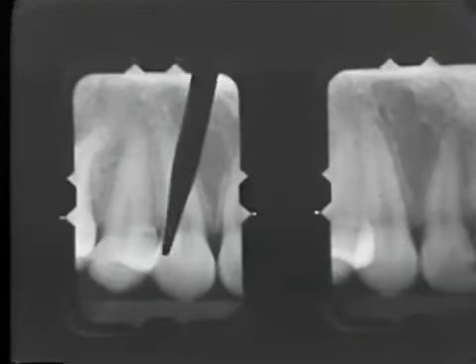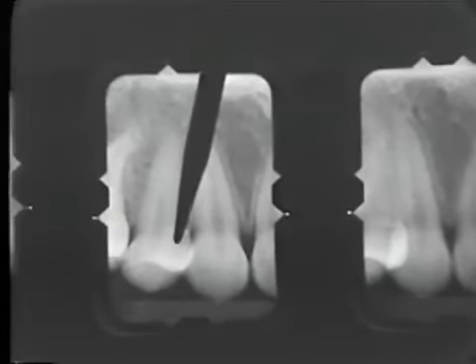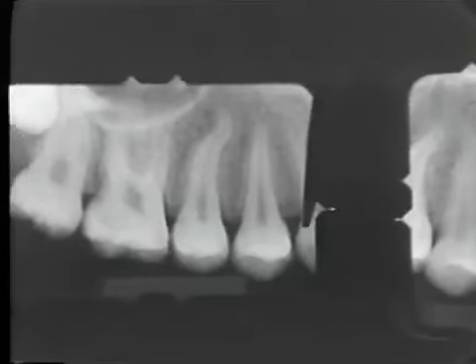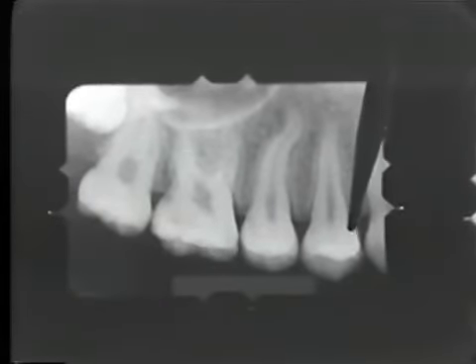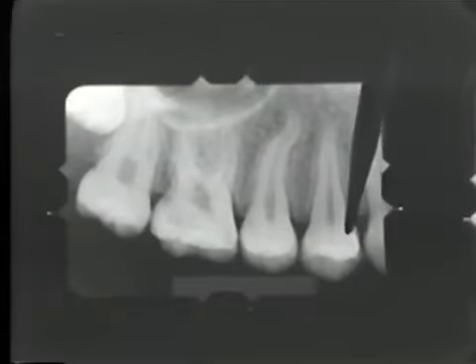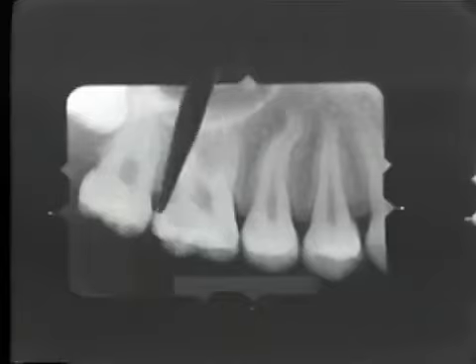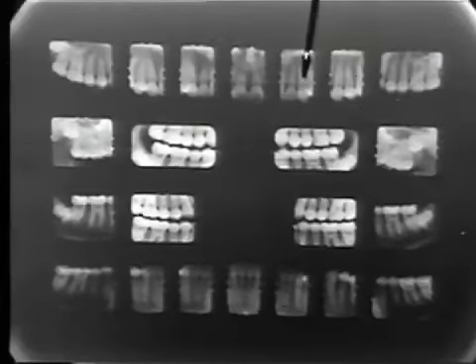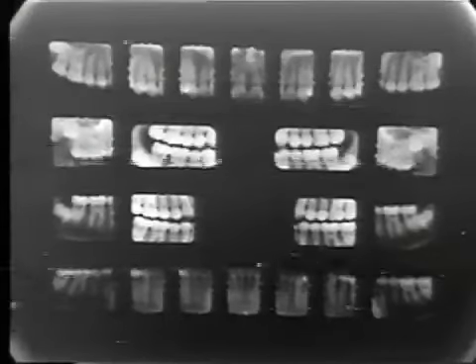The distal surface of the cuspid may be overlapped onto the bicuspid. So on the next radiograph, we endeavor to open the contact between the cuspid and the bicuspid, thus showing the distal side of the cuspid and the mesial of the first bicuspid, as well as the other contacts. So that's the scheme of events. Always try to open the mesial contact of the tooth that is currently being featured in the radiograph.